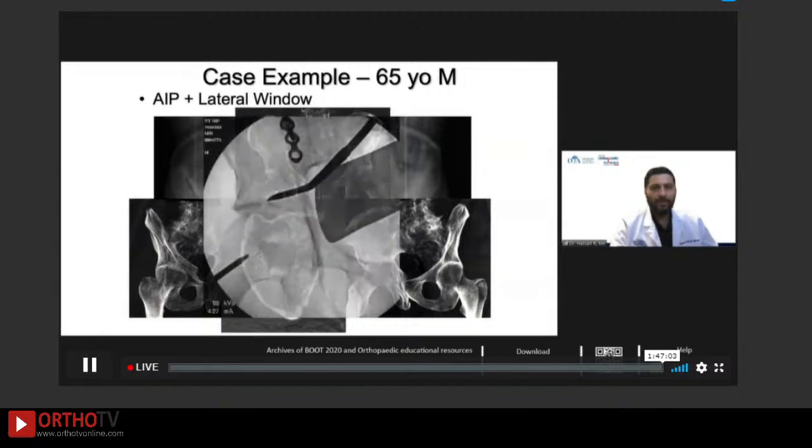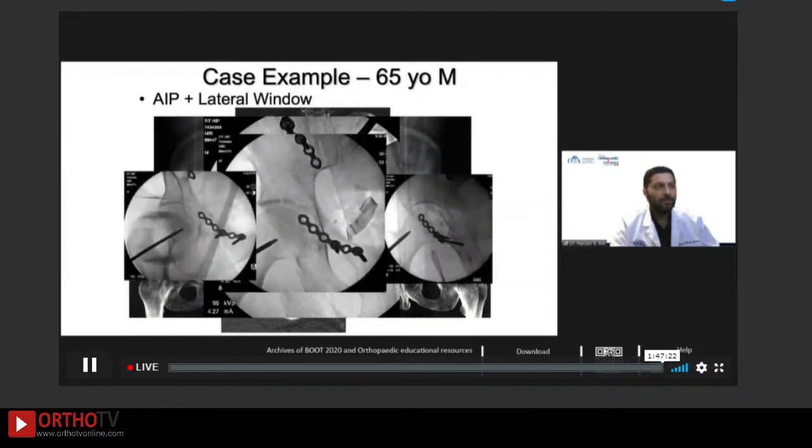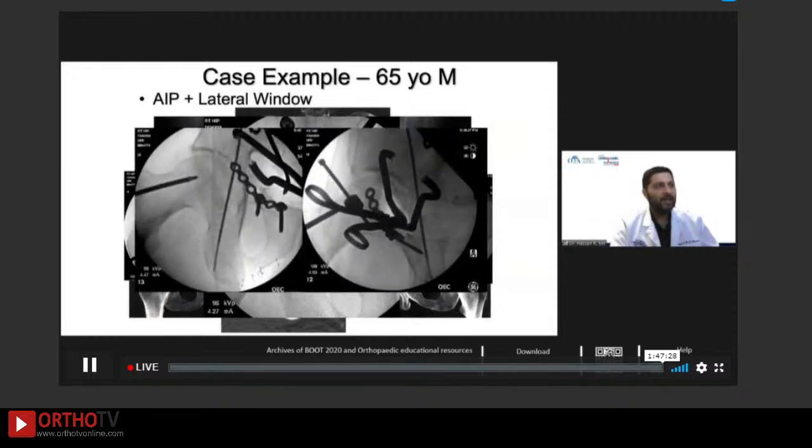So working through the lateral window in the AIP, you can see a small buttress plate through the lateral window to help reduce the posterior extent of the fracture of the anterior column. And then working through the AIP, we can directly visualize and manipulate the dome impacted segment. And then we're able to close the anterior column anteriorly with another small buttress plate. And then added our posterior column clamping through the AIP interval.